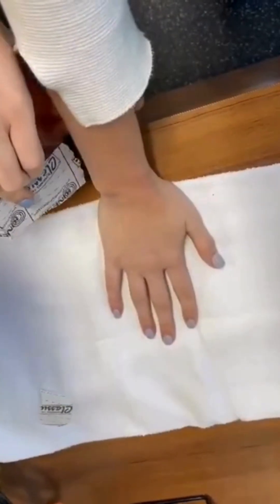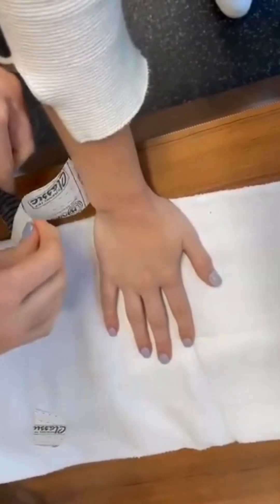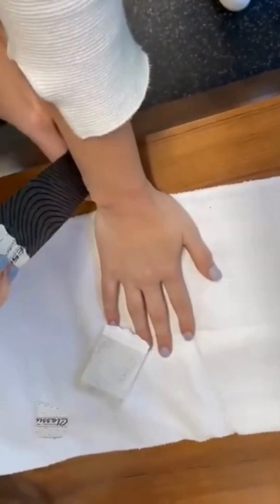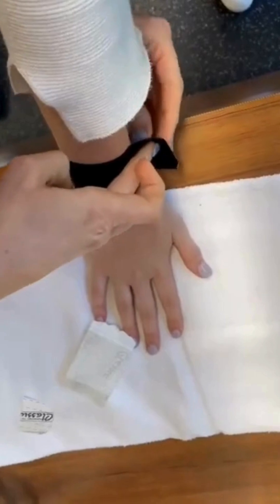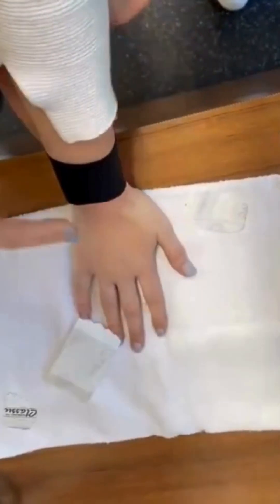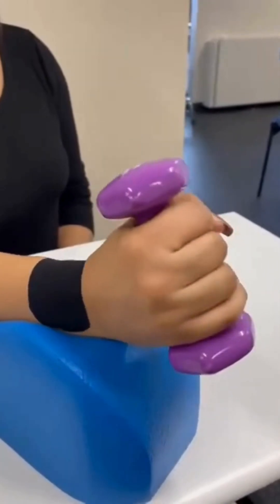Today we're going to discuss a kinesiotaping technique called EDF — Epidermis Dermis Fascia. The benefits of using this technique include decreasing pain by affecting neural tension so that the skin and scar are not strangling the nervous system. It facilitates homeostasis, decompression of a painful area, proprioceptive input, and enhanced motor responses.